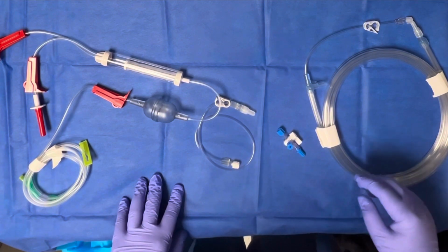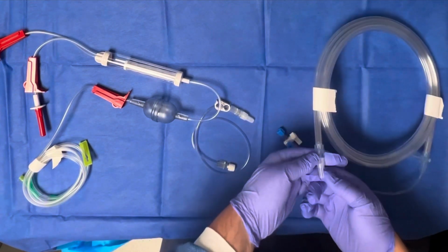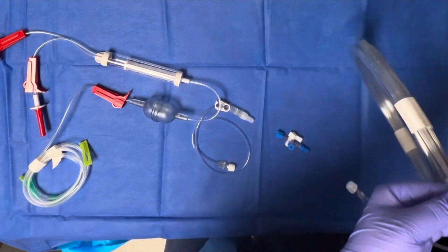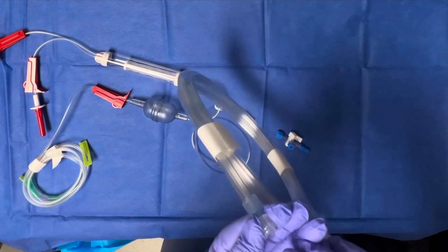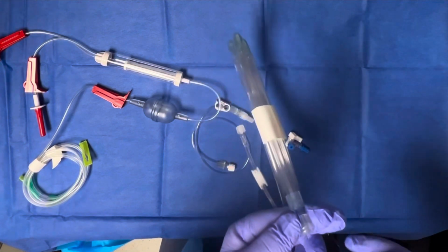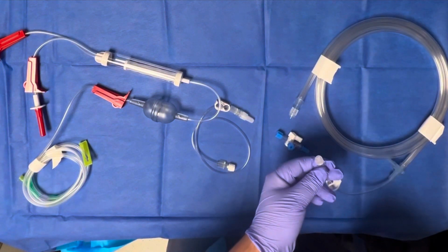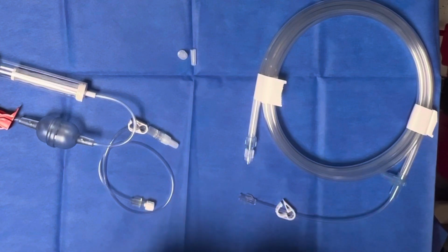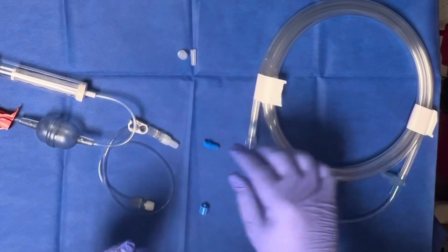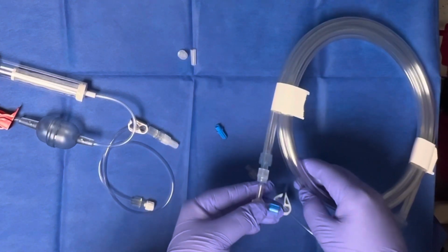So first you're going to take your coiled line and undo the top. When you take these caps off, every inner part of this is going to be sterile. So make sure not to touch these, because that will transfer infection if you touch them. All right, so then we're going to attach our stopcock to our coiled tubing, to the shorter end right here.